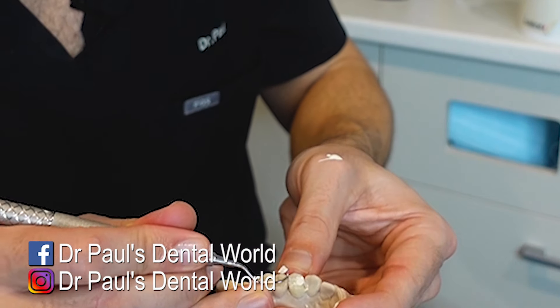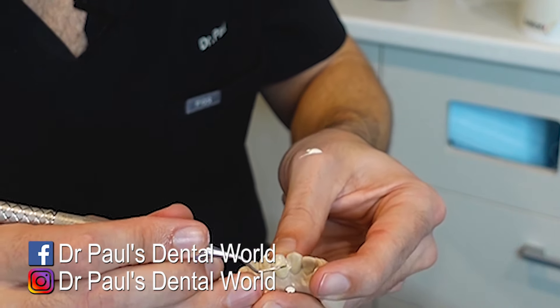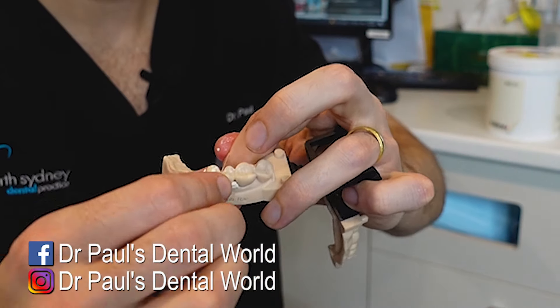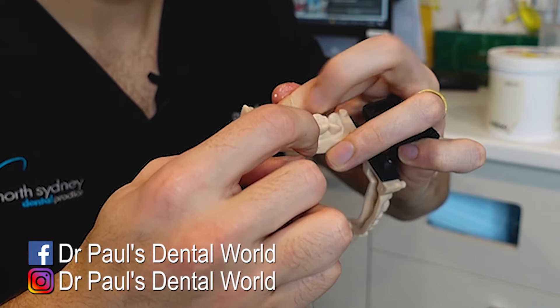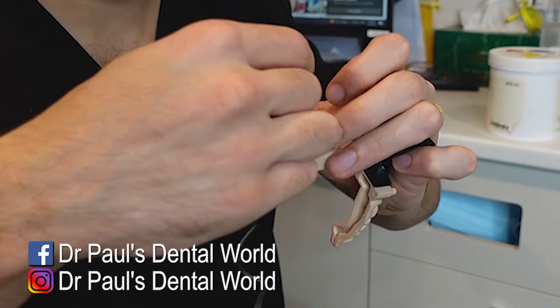Now the top bit, you can basically flick that off. So interproximally, you get your assistant to put their finger on top of the tooth. Then you floss up and down like this, pull out to the side. Same thing — assistant with their finger on top of the tooth just so it doesn't move.